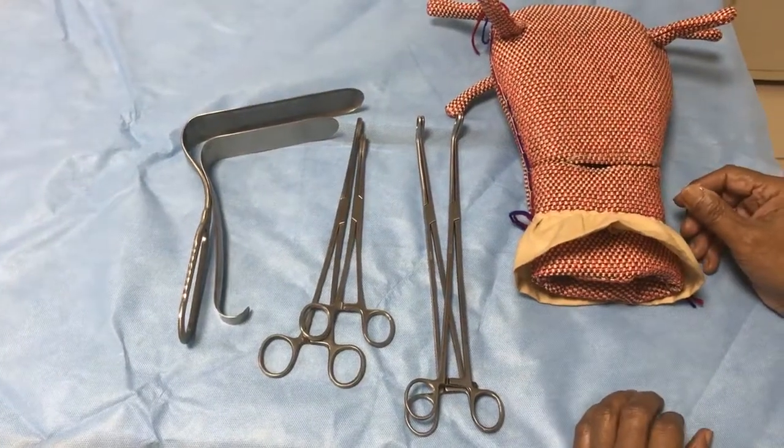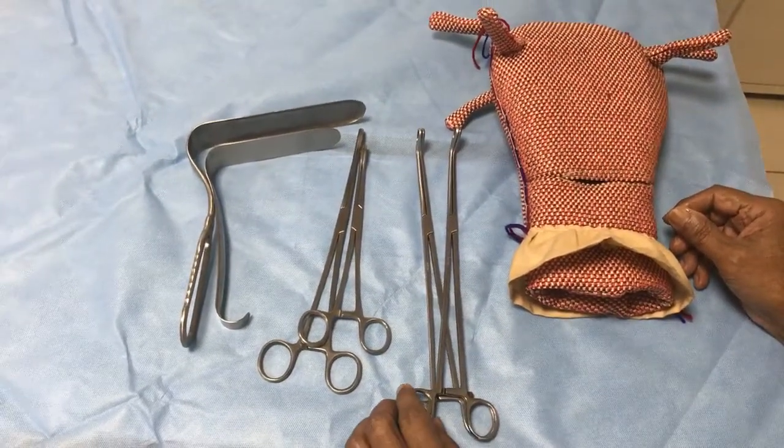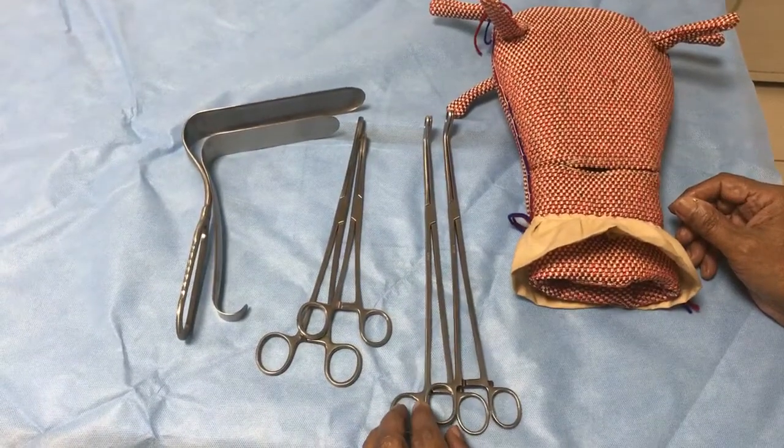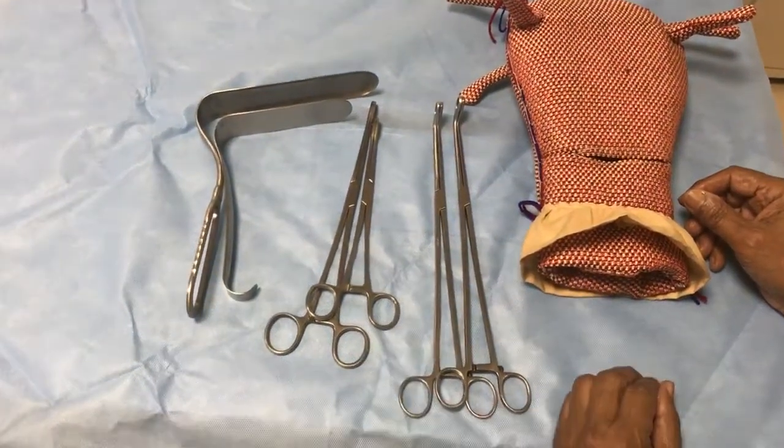This video demonstrates the application of a transvaginal uterine artery clamp to control bleeding from atonic postpartum hemorrhage (PPH).